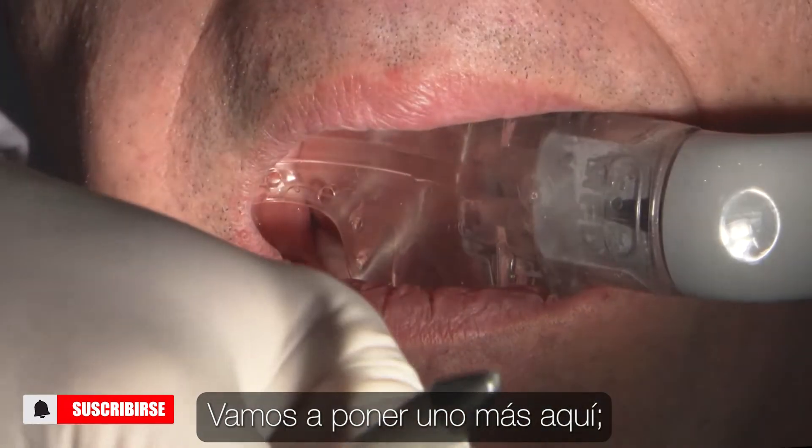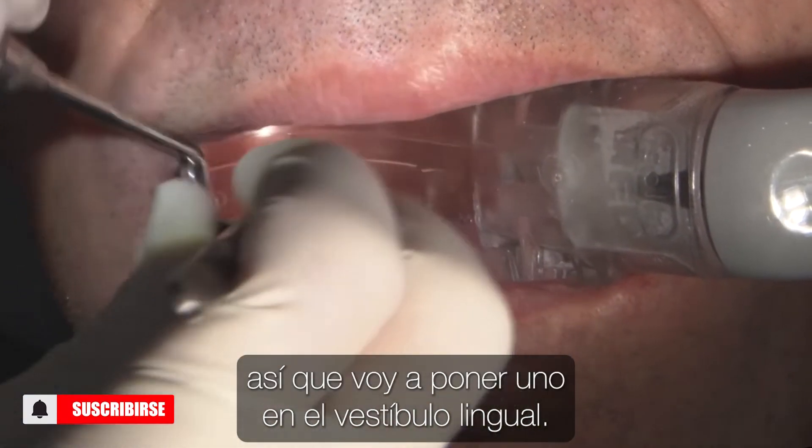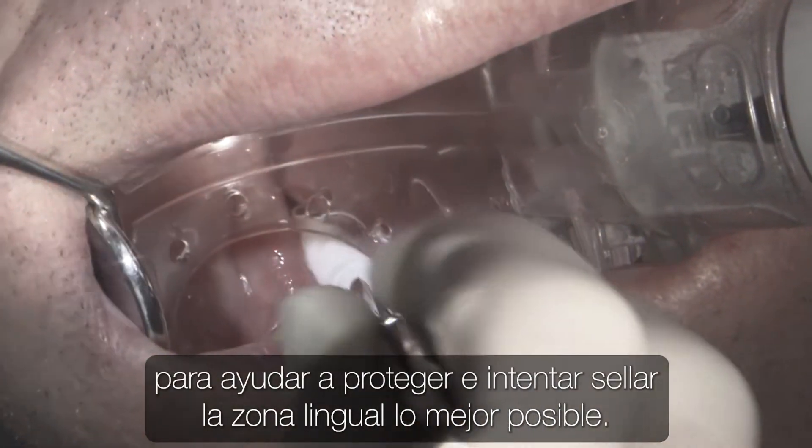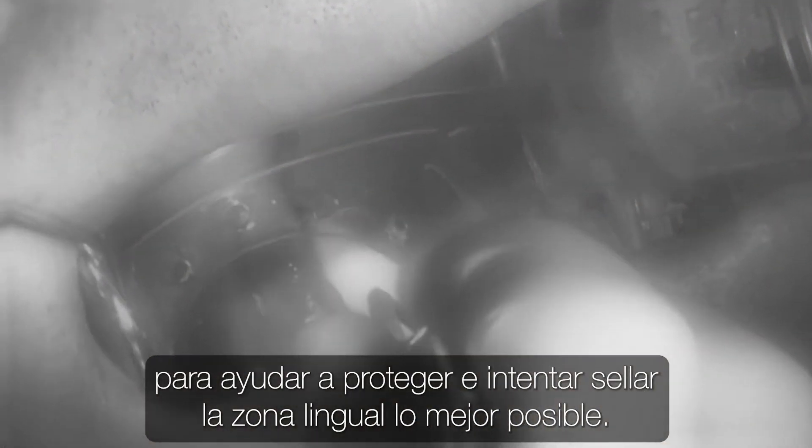Let's get one more here. I'm going to put one down in the lingual vestibule, and I'll follow that up with a second just to help protect and try to seal off the lingual area as best as I can.